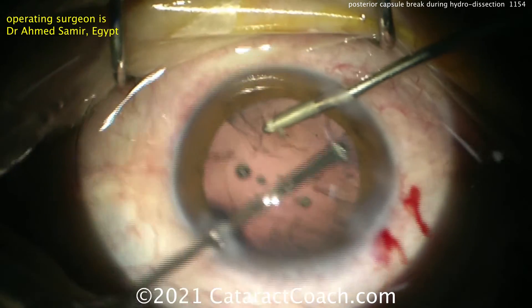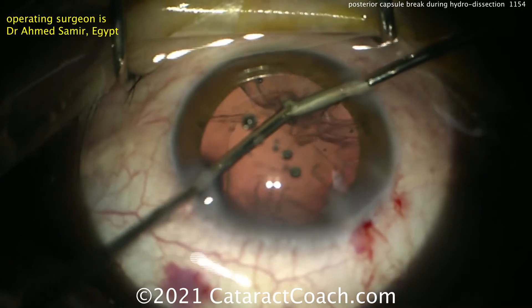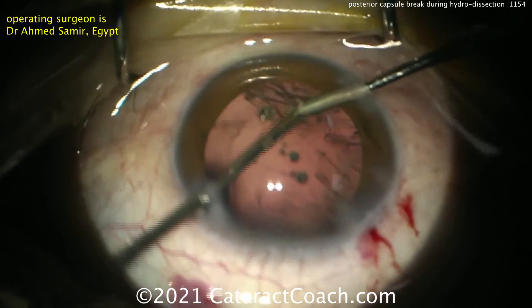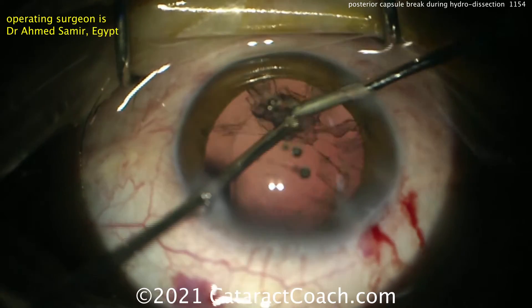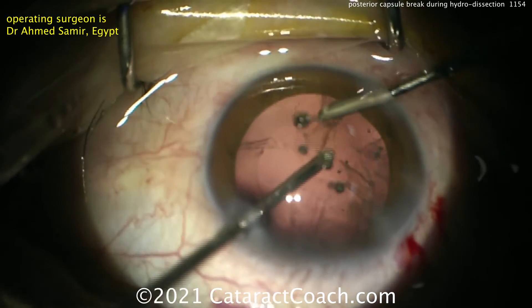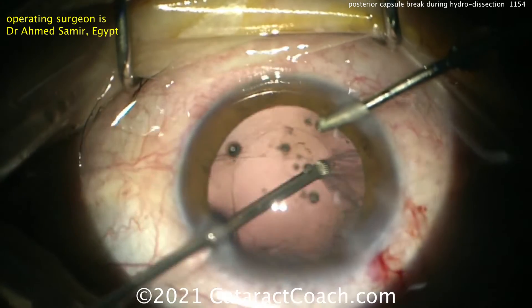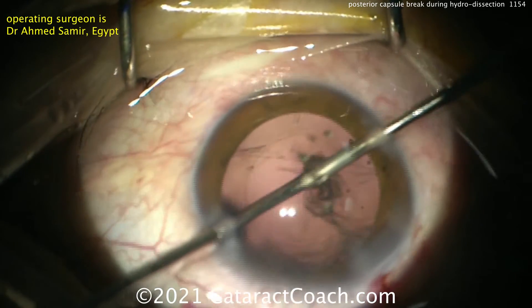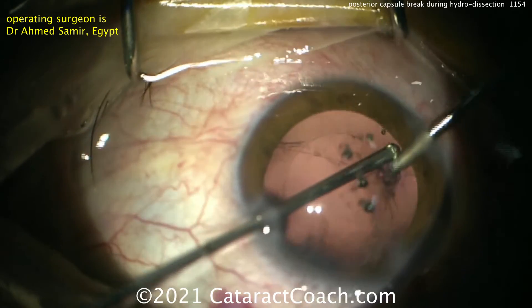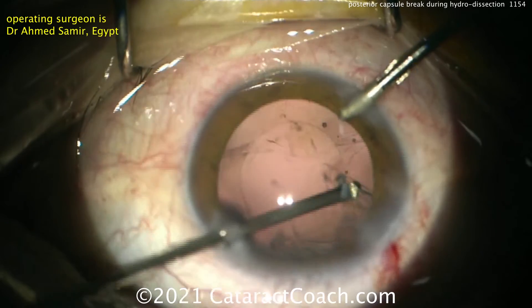Patients with an open or ruptured posterior capsule have a much higher risk of endophthalmitis, a higher risk of cystoid macular edema, and a higher risk of retinal break or detachment. You must watch these patients very closely in the post-op period. Dr. Samir has told me this patient did very well with a normal visual outcome — no complications in the retina, no macular edema, no infection, and no breaks or detachments. Everything fortunately turned out very nicely for this patient.